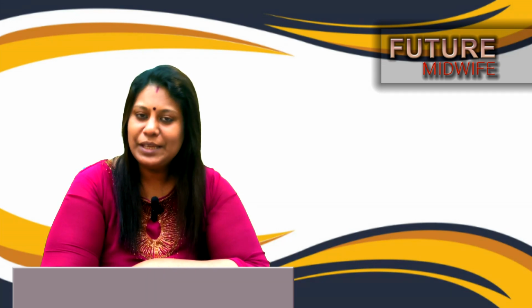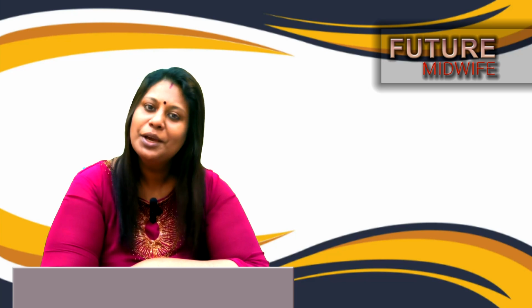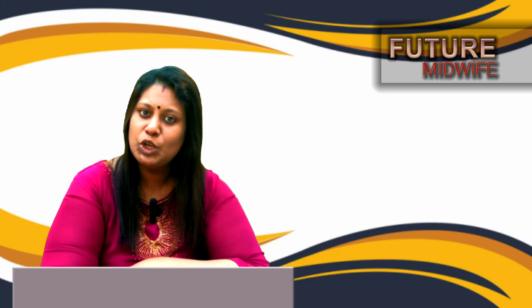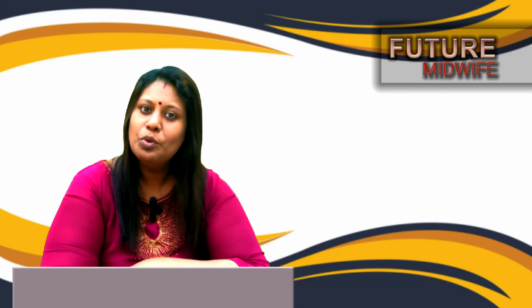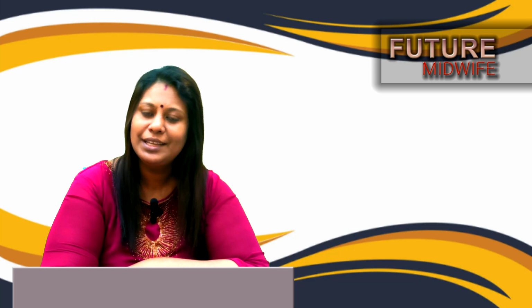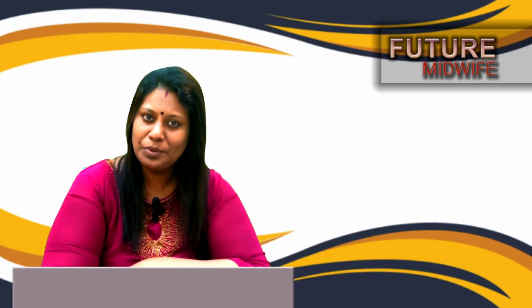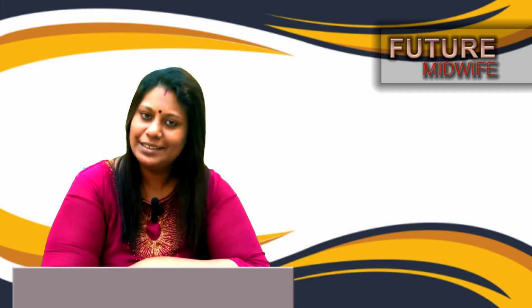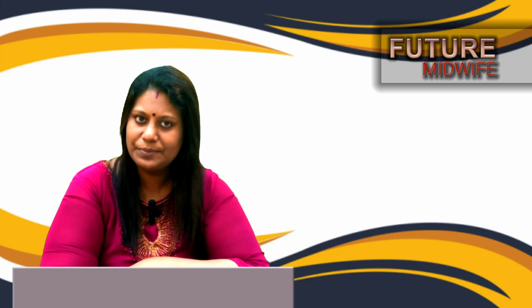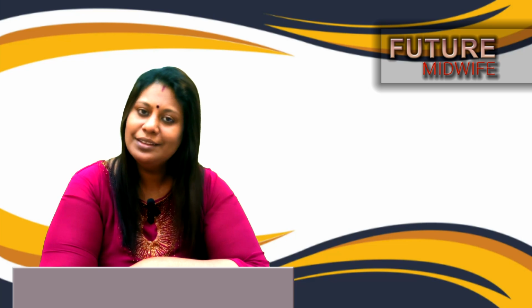Today I will discuss one of the diagnostic tests which we perform during pregnancy. Have you heard about the contraction stress test and the non-stress test? Both are performed during pregnancy in order to identify fetal well-being. Among these, today I will discuss the non-stress test. It is a simple and non-invasive test. That means it does not cause any pain during this test.